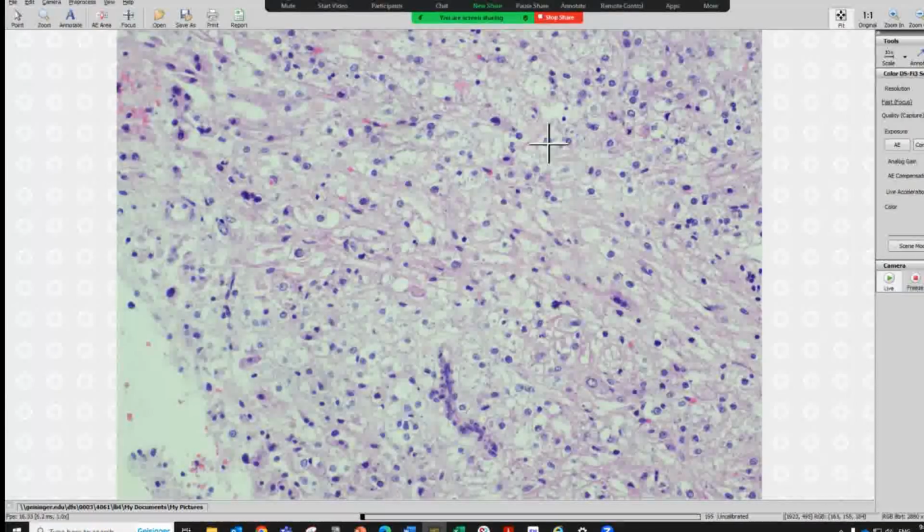And then all the cells just look like this. You may think of clear cell renal cell carcinoma, but one of the features didn't fit. What feature could you think of? Yes, we have a thickened blood vessel here. So even if it is RCC, you will really doubt yourself whether it is true RCC.